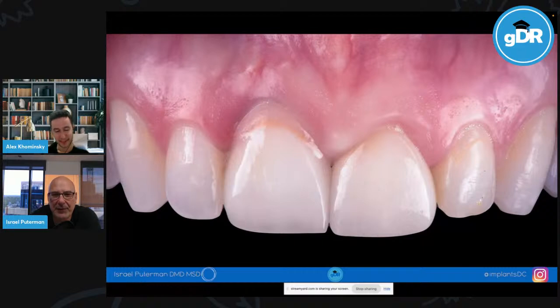I'm going to fix this up for you. So I give the dentist a call and I say, hey, what happened? What's going on? She said, yeah, the lab made it like this. And she thought the tissue would come down. And the patient really wanted the tooth that day. And so she felt bad taking the crown away from her and giving her back the removable and saying, I have to adjust it. So she put it in, hoping the tissue would come down.